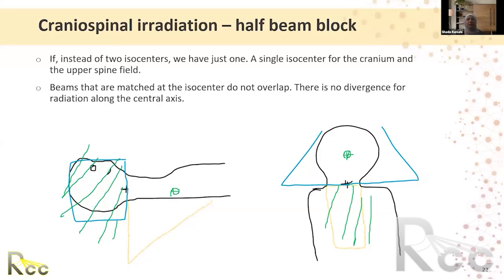For breast and head and neck, I have seen clinics that do not rotate either the couch or the collimator. And that's not okay. The hot spot will be there because of the divergence and one beam going into the other beam. For head and neck treatment, it will be in the soft tissue, so that will add to the hot spot that your patient suffers from.